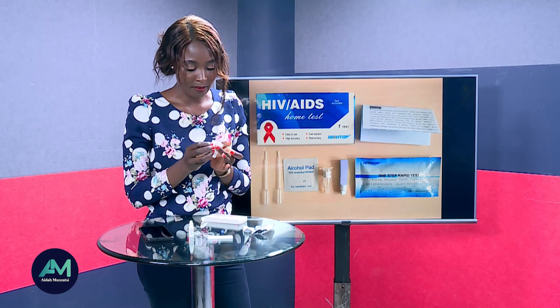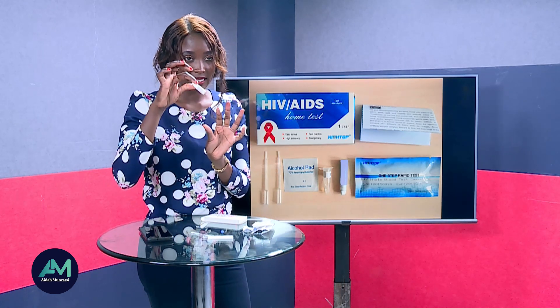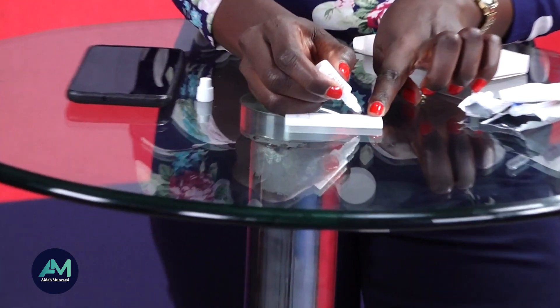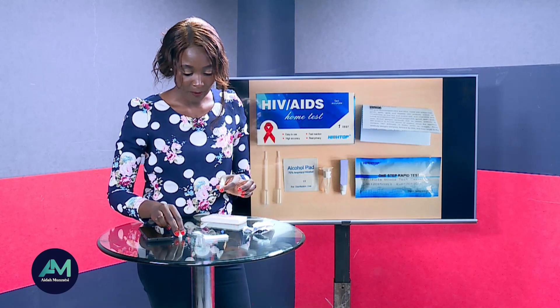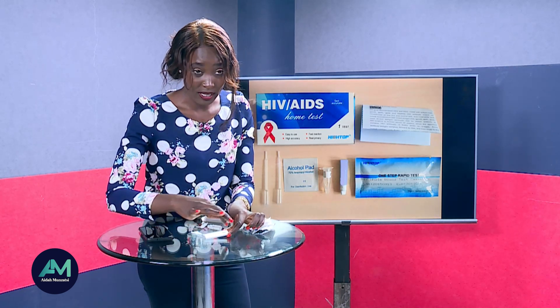Now we are going to use the blood diluter liquid. Open it and do two drops right here on the test: one drop and two. This just helps in diluting the blood. You can see the blood is already diffusing into the tester.